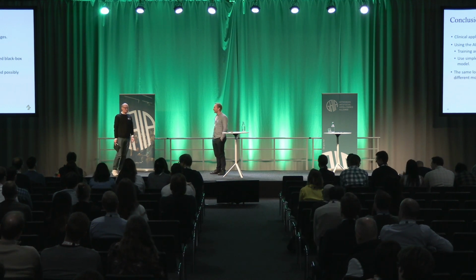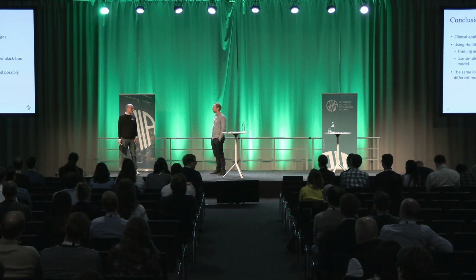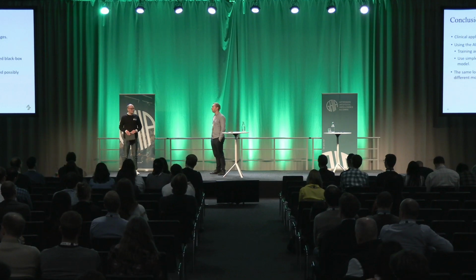Yes. That you pre-train a model and then you lock it and then you fine-tune some head for your specific tasks. Right. I guess the main difference between what is usually done is that we're not fine-tuning a new neural network model, and we're not fine-tuning the last layers of the current neural network model. The fine-tuning is on a very intuitive model that people can understand and that can be communicated. And that's the big difference. Okay. Yeah, that makes sense.